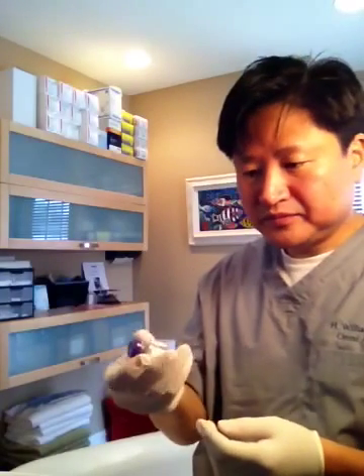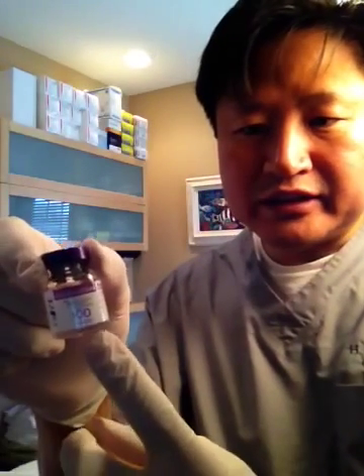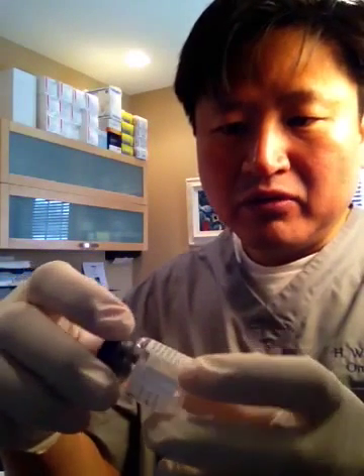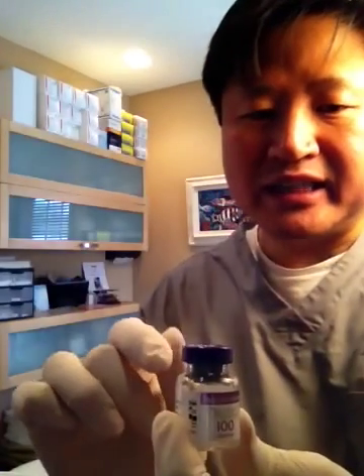We mix it up. There are 100 units of Botox in this vial, so if we use the whole bottle, that would be 100 units total. It doesn't matter how much fluid we put in — the amount of product remains the same.